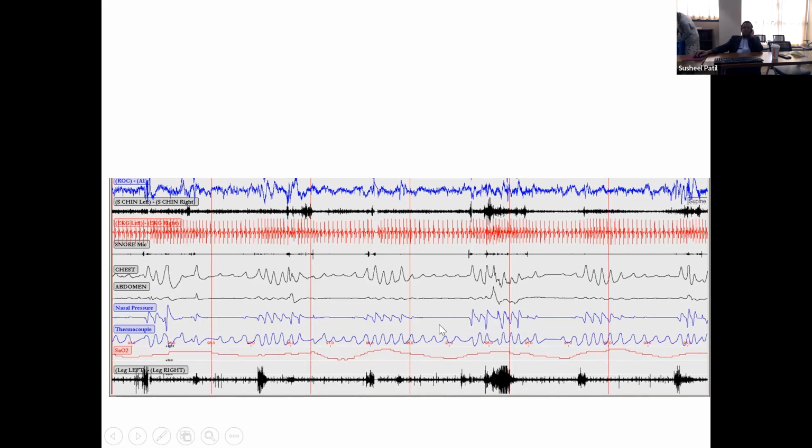Clearly the abdomen is not giving us effort, but the chest maybe reduced. And just going off what Rick had to interpret, it almost looks like something you put at the end of the chest trying to pick up. So I honestly don't know how to interpret that. I think you're right. We don't have enough information. I mean, you don't, unfortunately, right?